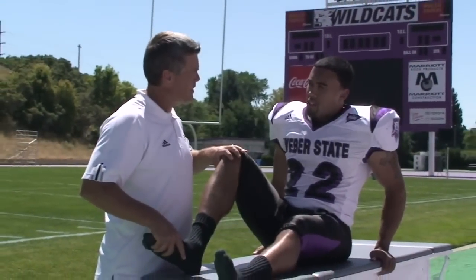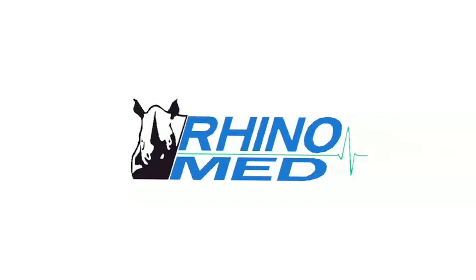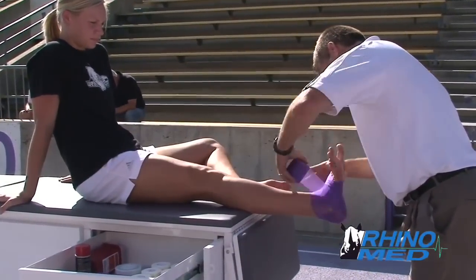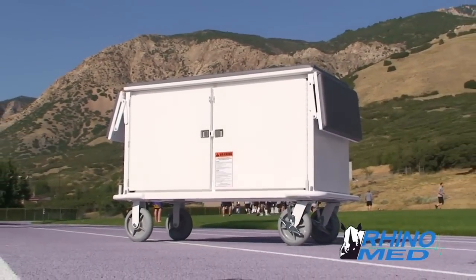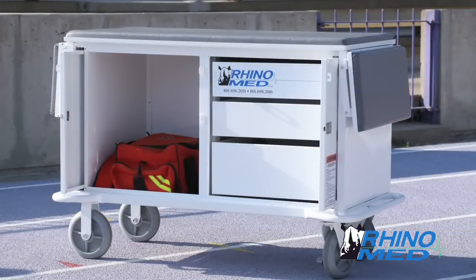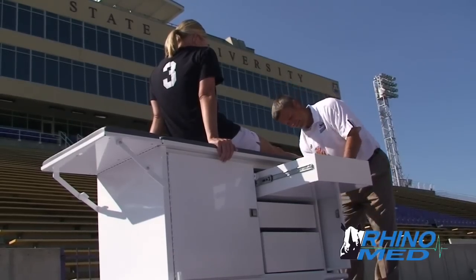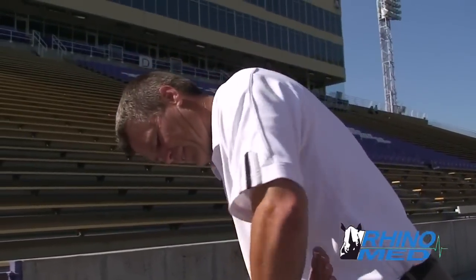Helping athletes perform at their best is a top priority for every successful program. RhinoMed creates solutions that give athletic trainers the edge they need in providing the best care for their athletes. The RhinoMed cart is an ultra durable, highly mobile athletic training room on wheels, designed to function on field and on court as a portable taping and evaluation table, allowing athletic trainers to focus on doing their job.